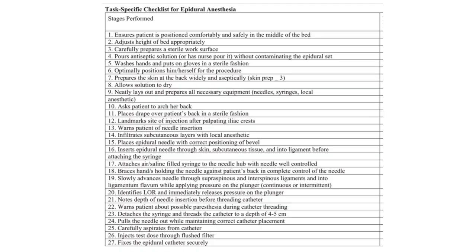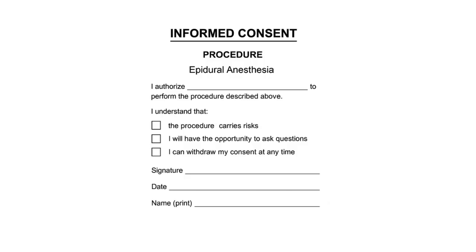Before we begin the procedure, I wanted to give you a visual of a task-specific checklist. It might seem like a lot of steps at first, but they follow a natural and logical flow. With a few practice runs, you'll find that the process becomes more second nature and easy to perform without needing to memorize each step.